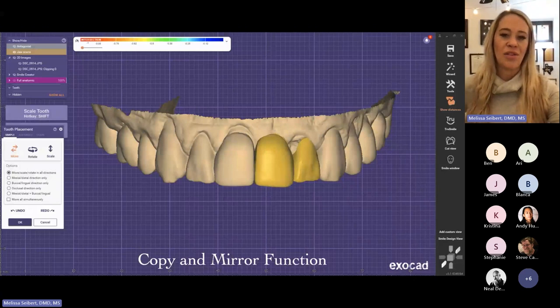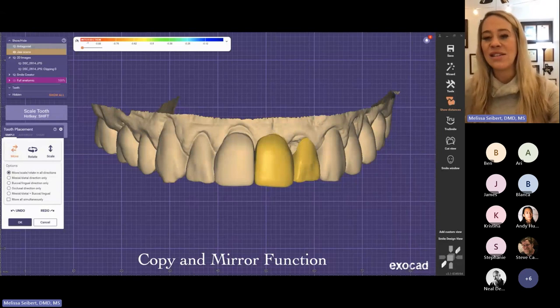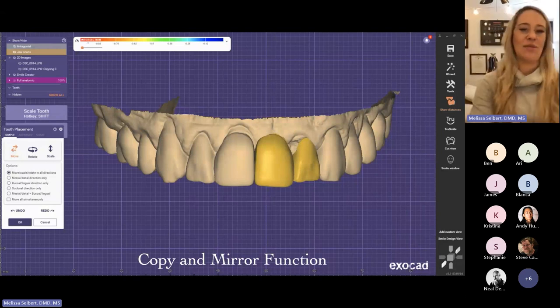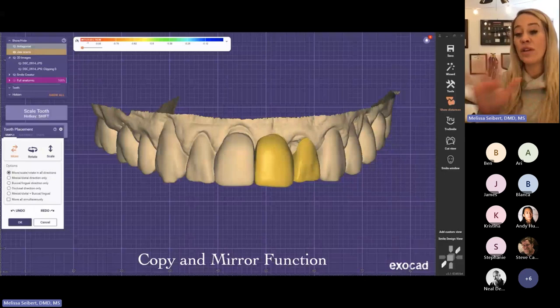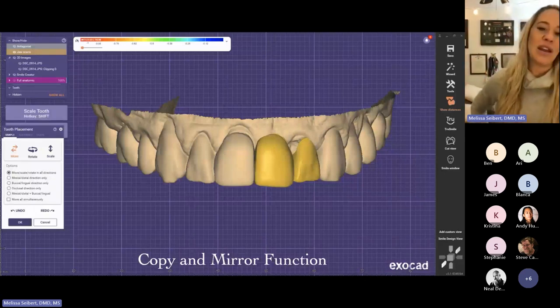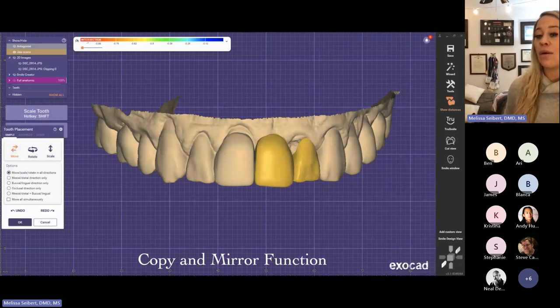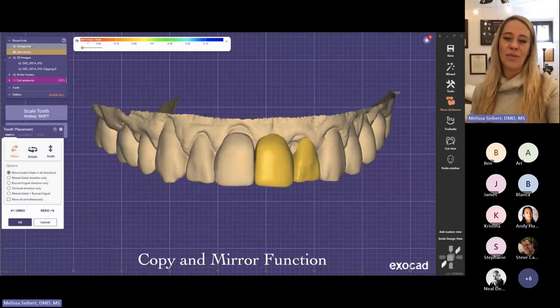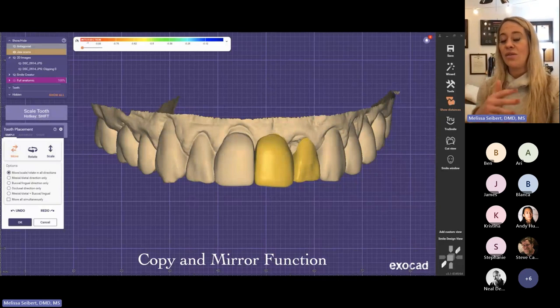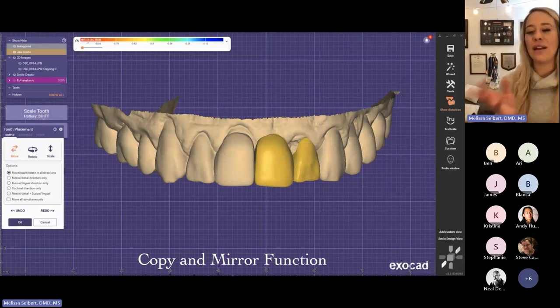Once we used the copy mirror function, I was able to replicate teeth 7 and 8 right then and there. I'm not crazy about the crown on number 8 — this is actually a hybrid ceramic, kind of a printed composite on a stick situation — but the patient was totally okay with that. I use the copy mirror function quite frequently. If there's a tooth the patient really likes and wants replicated, I can do that. With implant planning, if I'm planning for a posterior molar, I'll copy and paste that tooth rather than spending extensive time waxing up a tooth if I like the occlusal scheme.